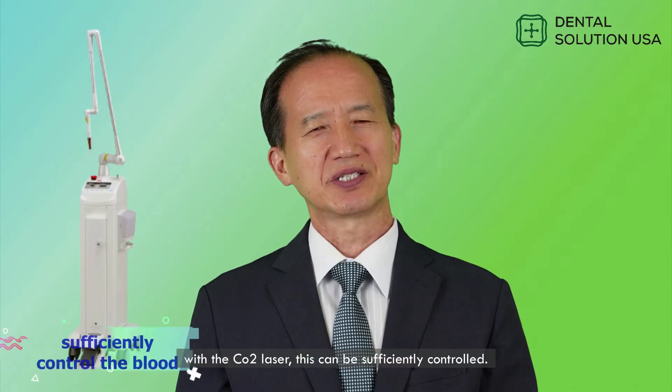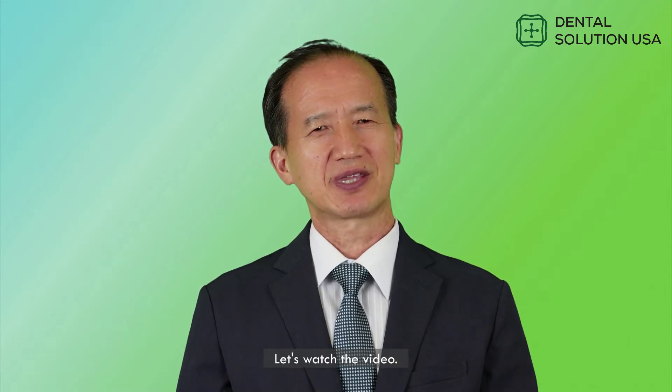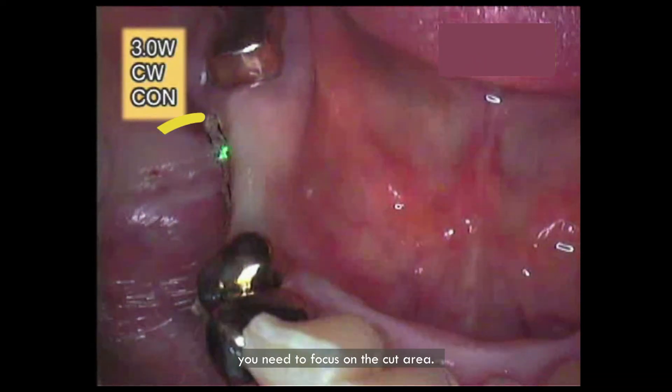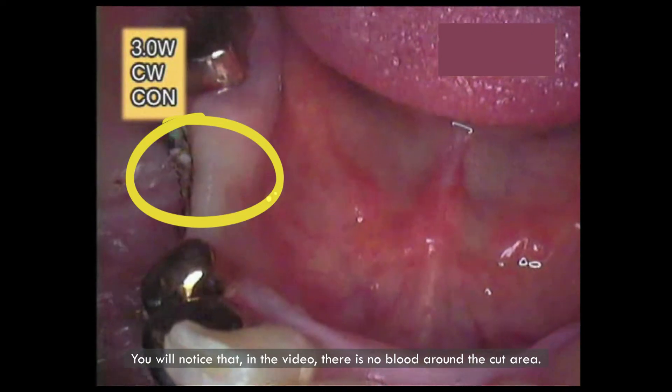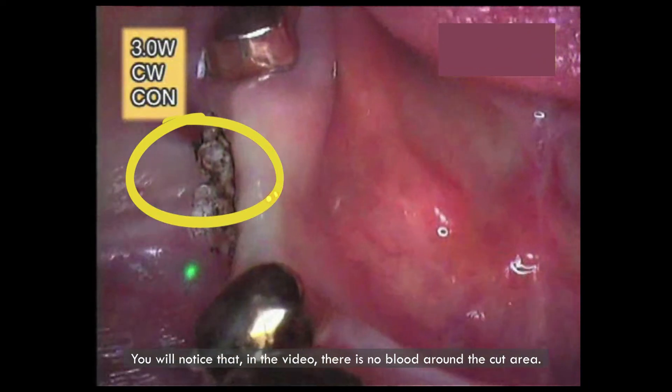However, with the CO2 laser, this can be sufficiently controlled. Let's watch the video. In this case, you need to focus on the cut area. You will notice that in the video, there is no blood around the cut area.